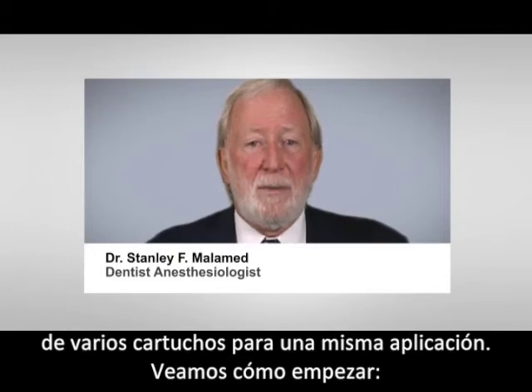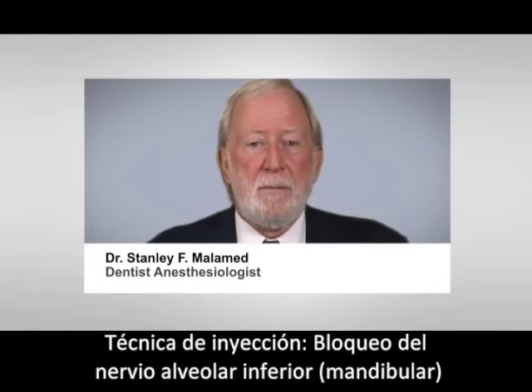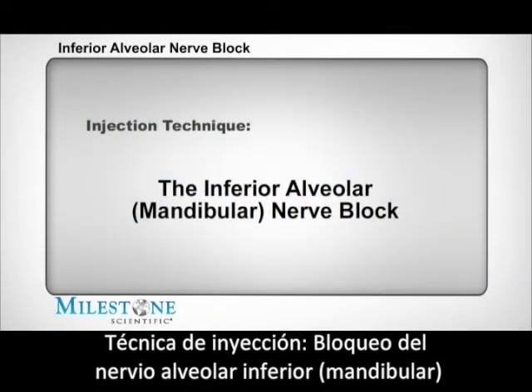Let's discuss how to begin. Injection technique: the inferior alveolar mandibular nerve block.